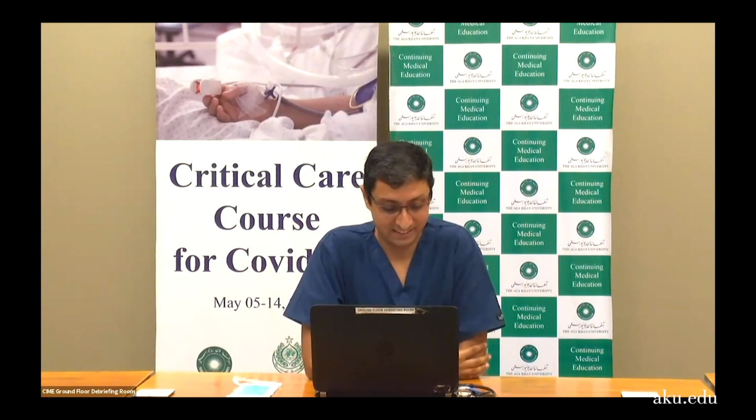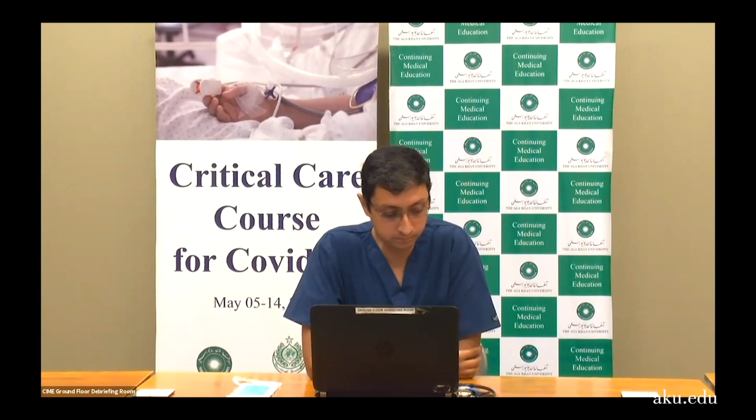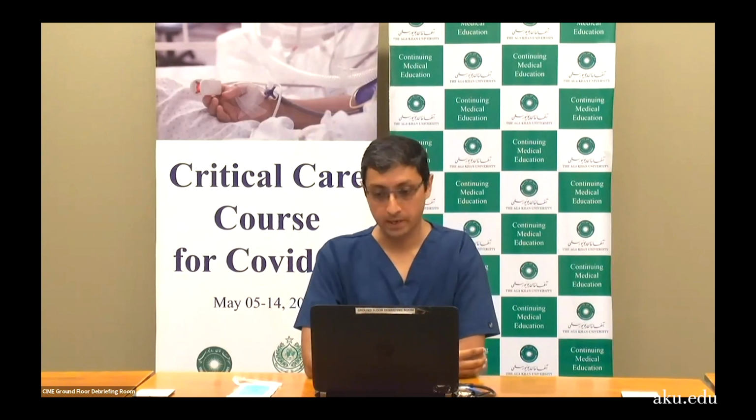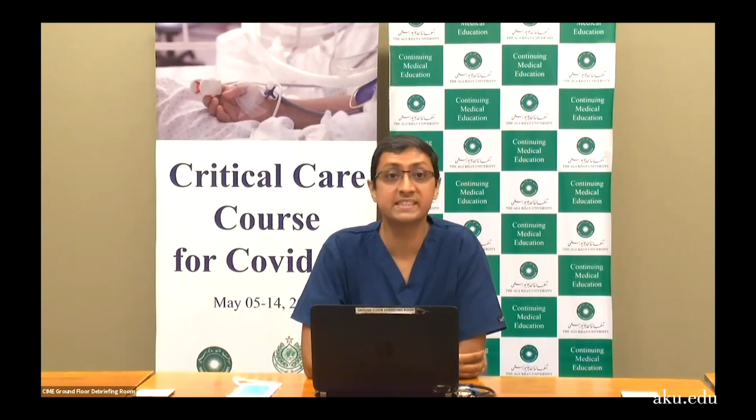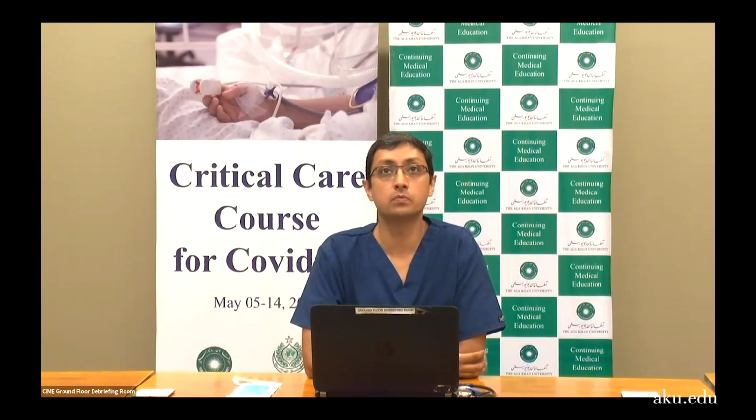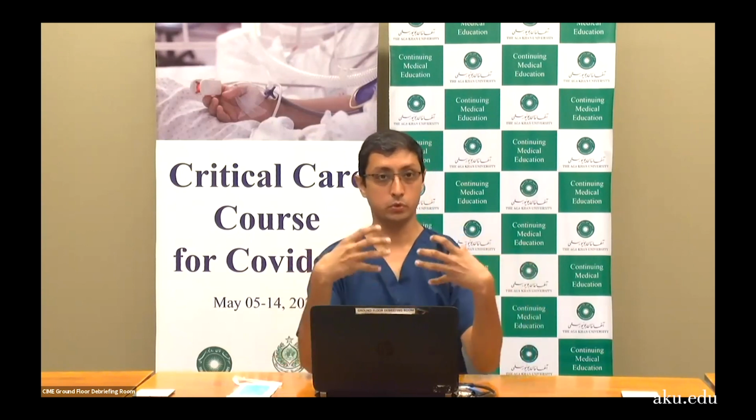What is the minimum trigger and criteria for setting the trigger according to each individual patient? So there is no minimum, there is no maximum, but you need to be aware that the lower numbers you go, the more sensitive it becomes. So for a patient with a hyperdynamic circulation, it is going to trigger more often.